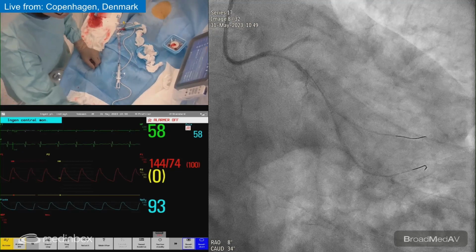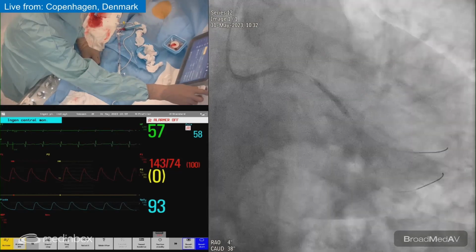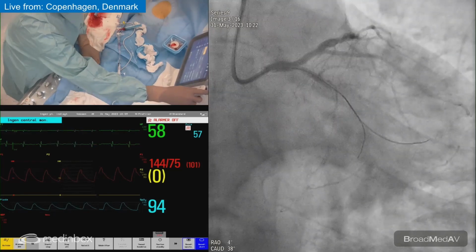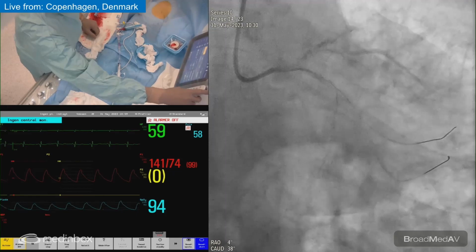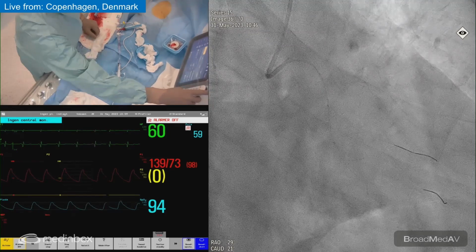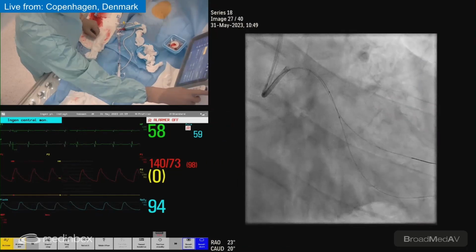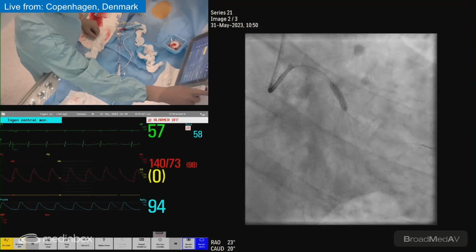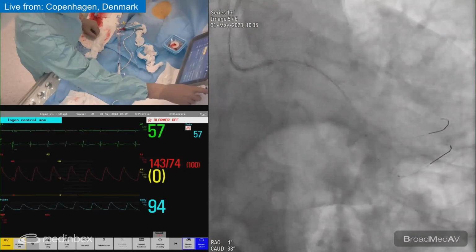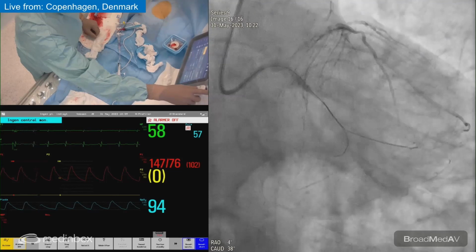We had one where we could actually see the small side branch there. It was before these larger balloons. You didn't save a picture then.